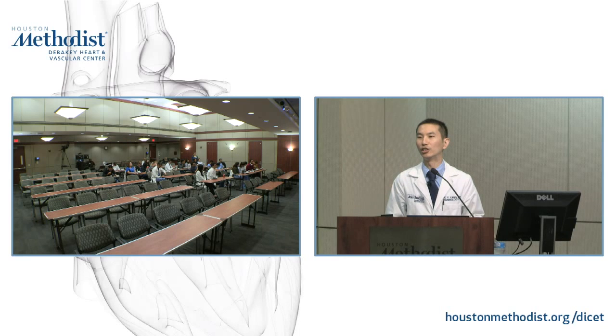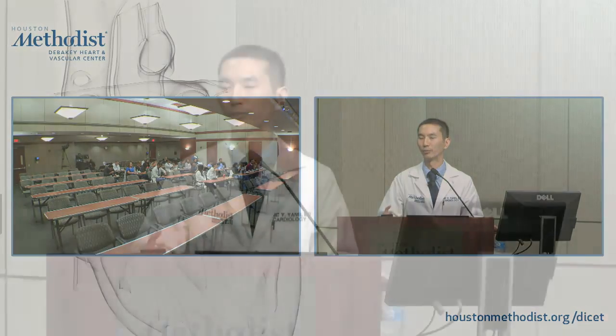The issue is that's difficult. If it localizes in a coronary territory, we become a bit more suspicious for coronary disease. But if we see it as diffuse subendocardial, then it's hard to say because you're facing the potential issue of balanced ischemia as well. But then again, we would see the perfusion abnormality regardless. Okay. Thank you.